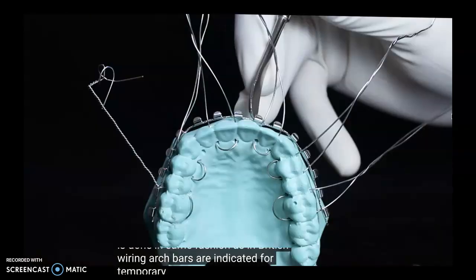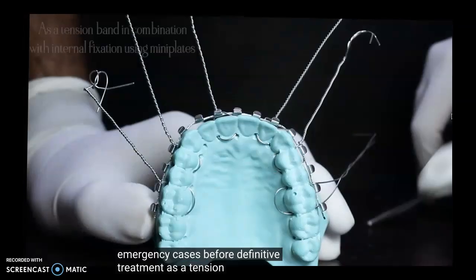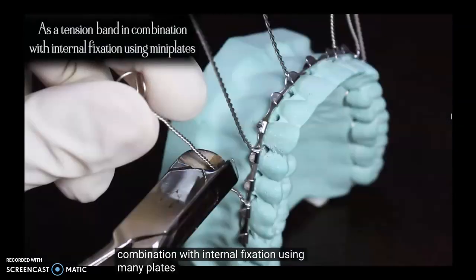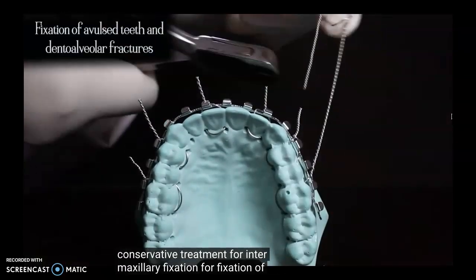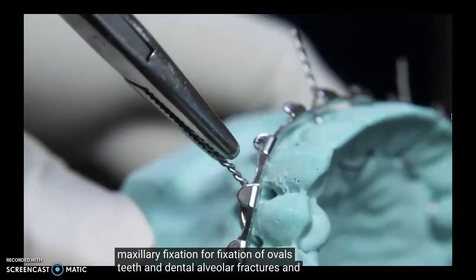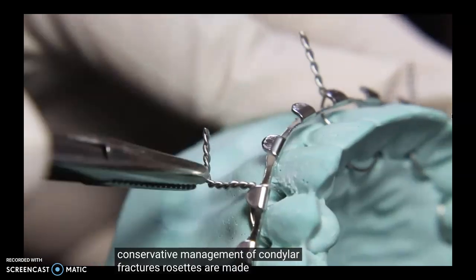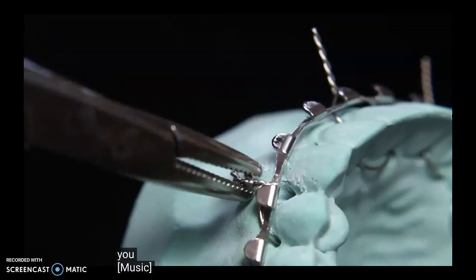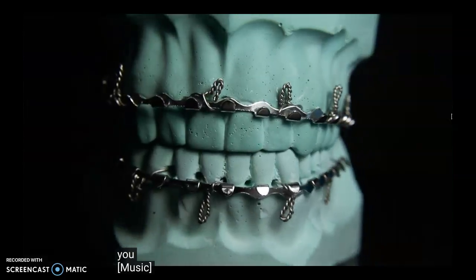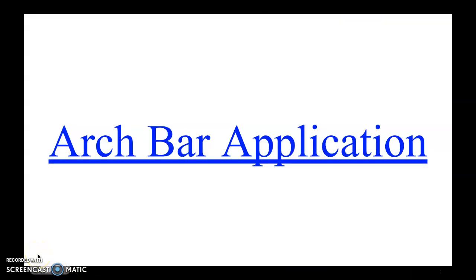Arch bars are indicated for temporary fragment stabilization in emergency cases before definitive treatment, as a tension band in combination with internal fixation using miniplates, for long-time fixation in conservative treatment for intermaxillary fixation, for fixation of avulsed teeth and dentoalveolar fractures, and conservative management of condylar fractures. Rosettes are made. So obviously that just showed what the procedure would look like.